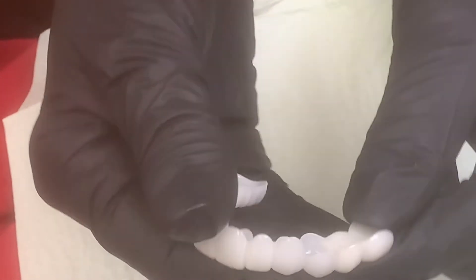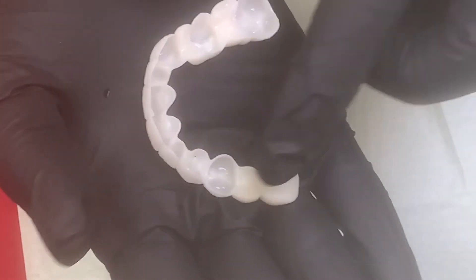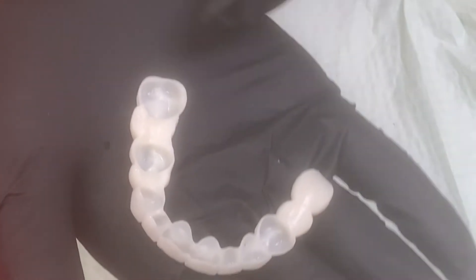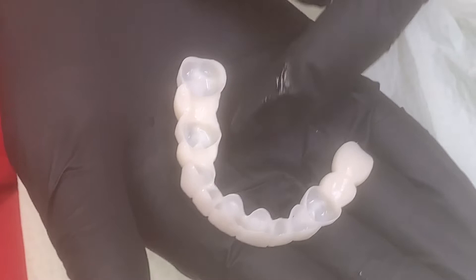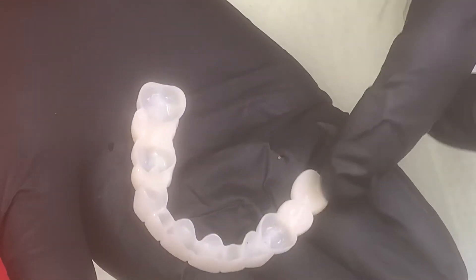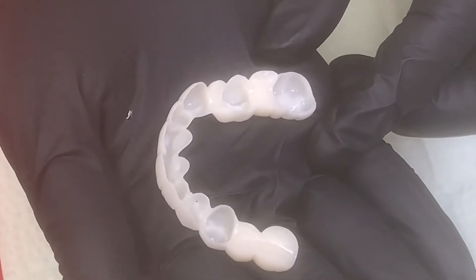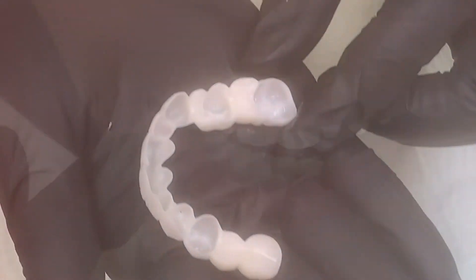You can see on the upper left where we've replaced her missing teeth, and on the upper right, you can see where we've also replaced the missing teeth, and it literally just snaps into place. We're not using glues, we're not using adhesives, we're using nothing. It snaps in because of the retention from the existing teeth.